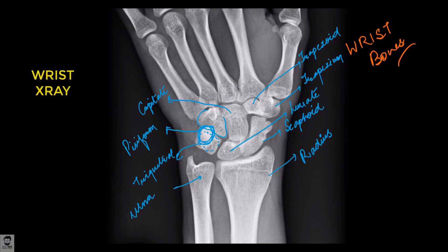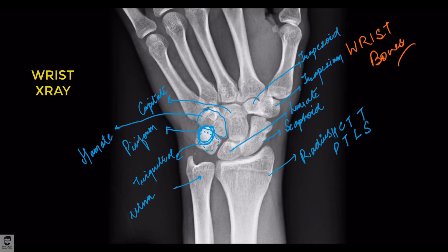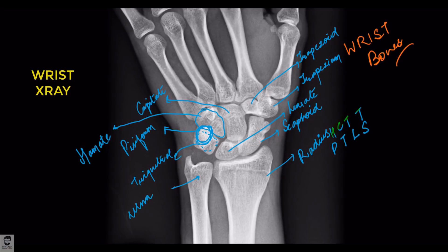The last bone next to the capitate, the one being marked here, is the hamate. There is a small hook of the hamate which is very important to identify. So to summarize: proximal row lateral to medial is scaphoid, lunate, triquetral, pisiform; and distal row lateral to medial is trapezium, trapezoid, capitate, and hamate. Hope you enjoyed the video.